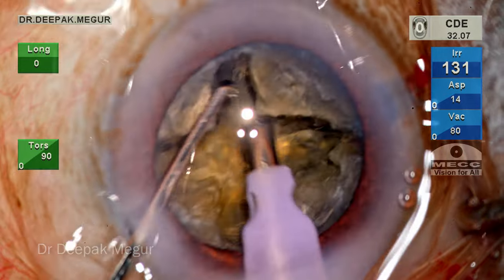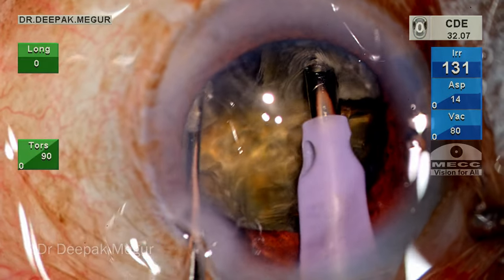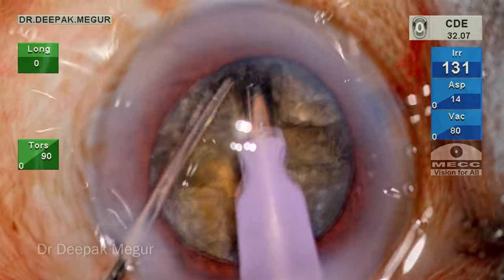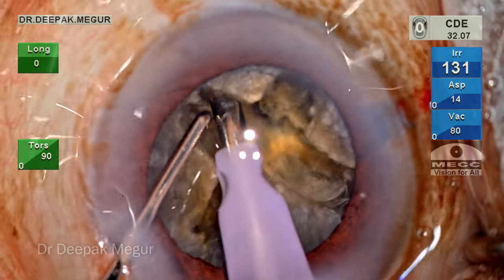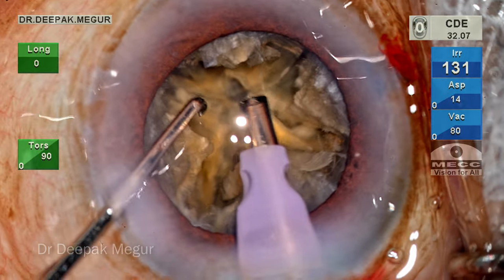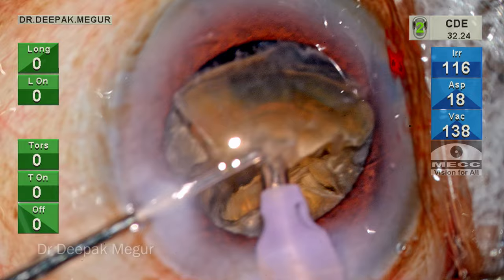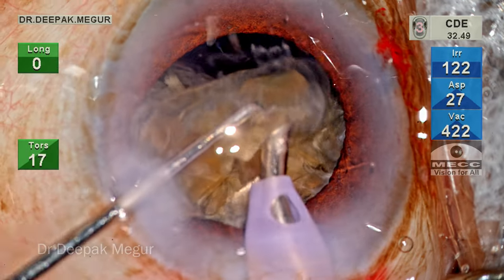The lateral separation maneuvers are continued with the goal of extracting at least one piece. I am trying to do the lateral separation maneuver as gently as possible. The central posterior plate is still refusing to give way. I rotate the nucleus to find one free fragment — if I can get one fragment out it would definitely ease my job. The last two fragments on my left-hand side seem to have the least attachment to the central posterior plate, so I choose the one at a slightly upper plane as it has less resistance to be pulled out of the bag. I pull it out and there is a small pedicle attached at the base, but it is small enough to maneuver the nucleus out with it still attaching.